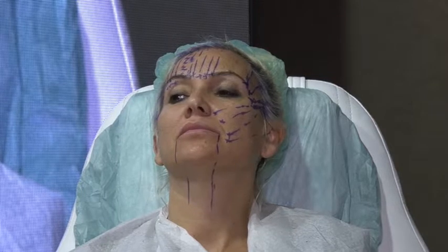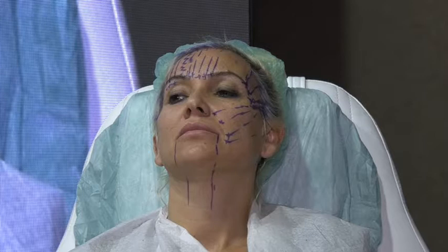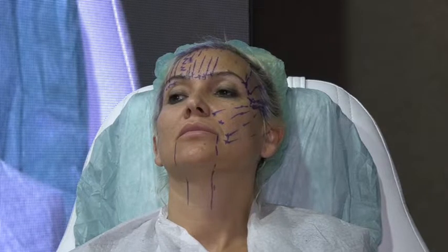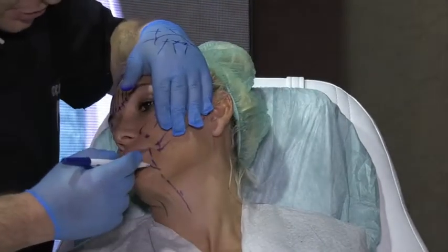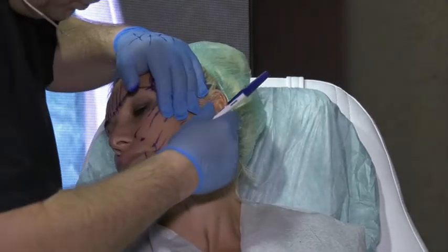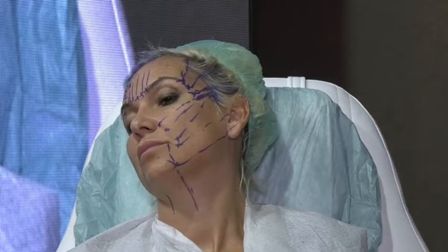What's the benefit of this line? This is going to be my entry point line. So usually we agree the zone requires almost 3 threads, but sometimes even in this simple case, you can put only 2 in the lower face. It's more than enough. So I put another one just above the jawline. Look, the jawline, just half centimeter above the jawline, you're going to go till the ear lobule, like that. So that's my jawline definition thread.